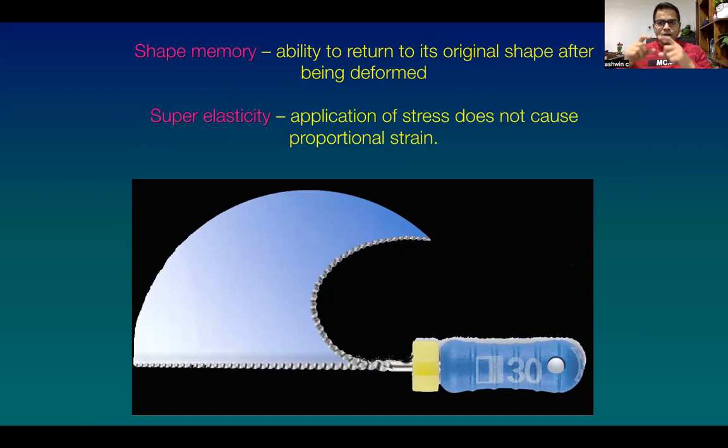So what will happen? You have the round apical foramen, but the moment you keep your file rotating there, it will try to get straightened up. When it tries to straighten up, it will enlarge the foramen and make it teardrop shaped or bigger. This is called transportation of the apical foramen, relocation of the apical foramen. Now you don't have any gutta-percha which is teardrop shaped or oval. You have a round gutta-percha. So when you put a round gutta-percha there, there is space all around, and that is one of the reasons of failure.